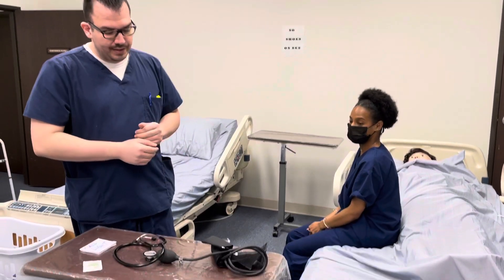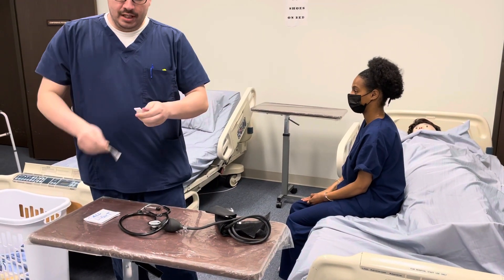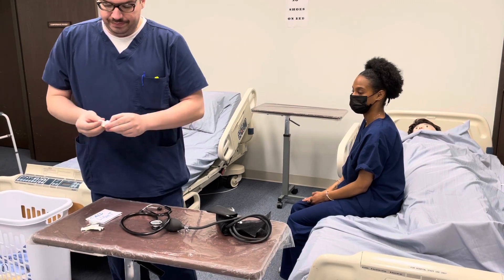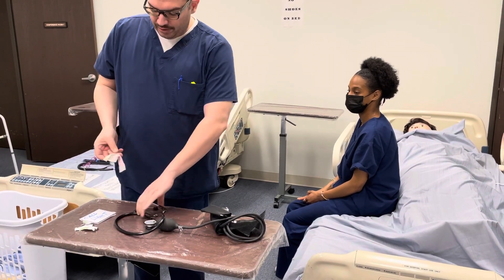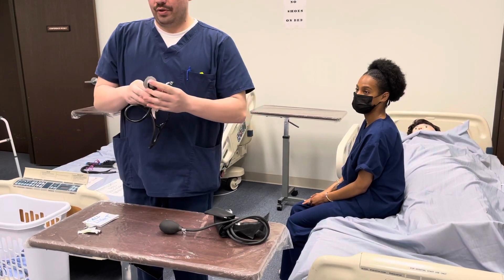The equipment that I need is a stethoscope and a blood pressure cuff, also known as a sphygmomanometer, and you need alcohol wipes. So I will open up my alcohol wipe and I will clean the earpieces and the diaphragm of my stethoscope.